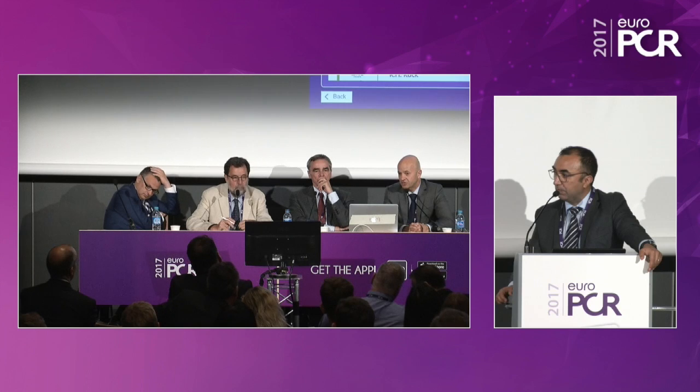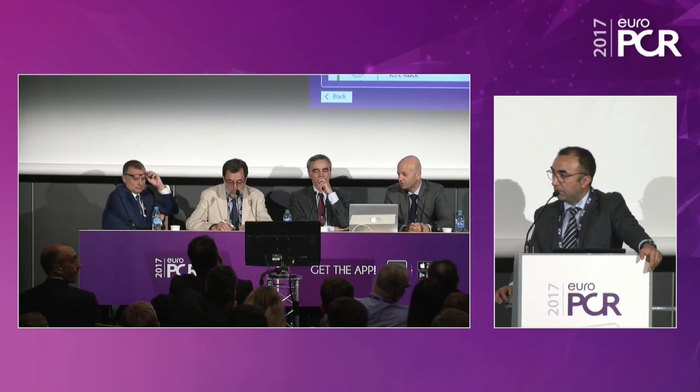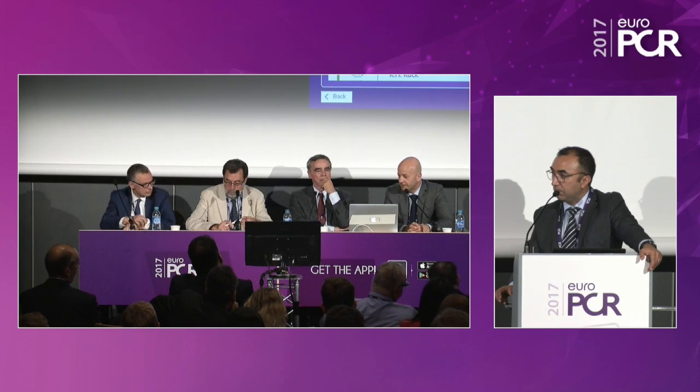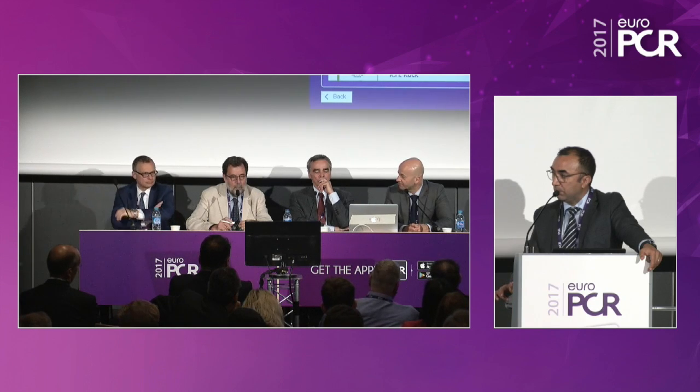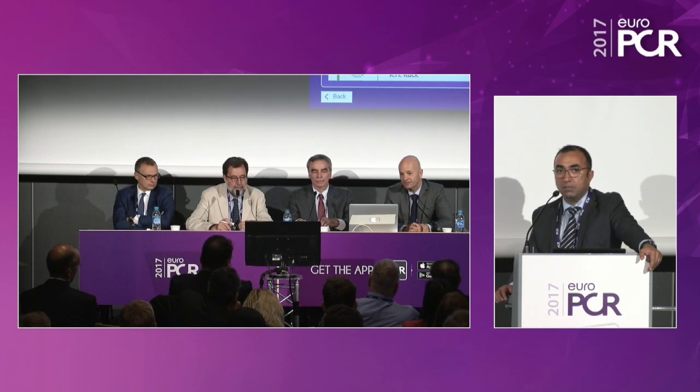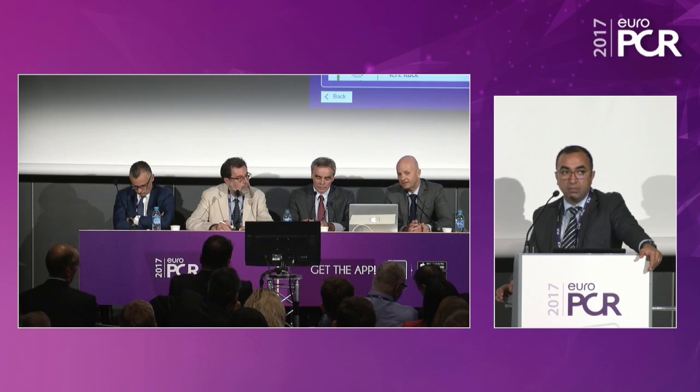So why are the data so encouraging? I think Francesco mentioned it already. We can adjust in real time on a beating heart, so we know exactly what we are doing. The surgeon is off pump, is on pump during fixing the ring to the annulus, and then he has to refill, and he looks at the regurg after putting water into the left ventricle. So it's a pretty artificial system. So he has to guess quite a bit. That is one major issue.